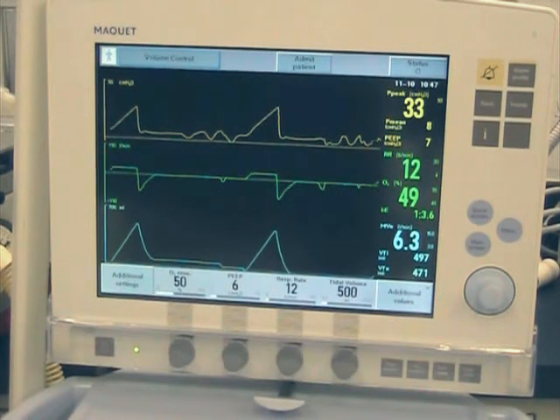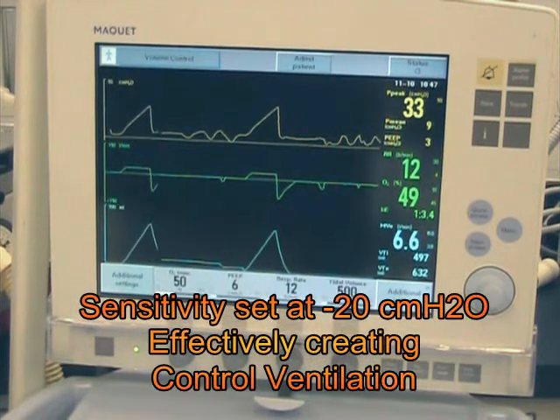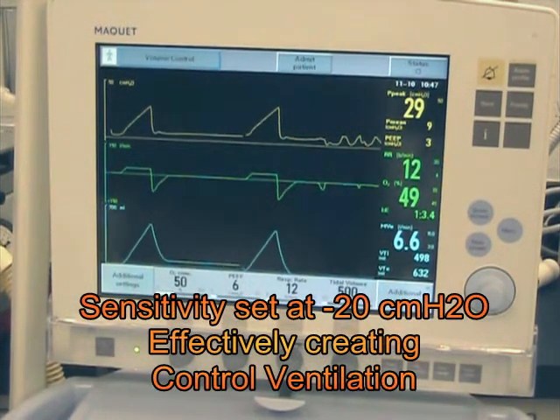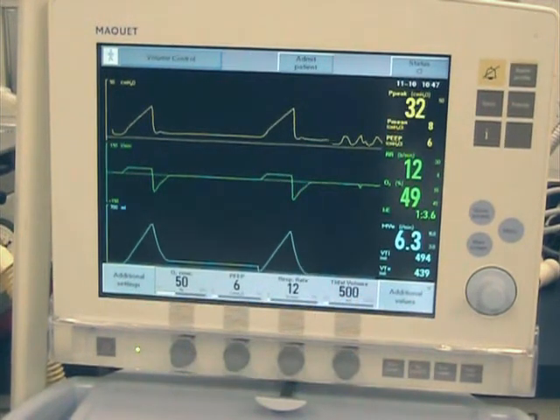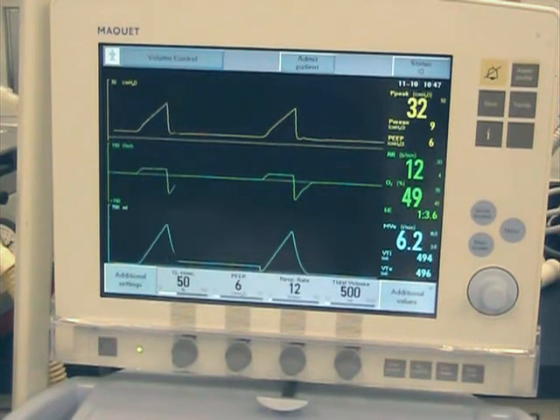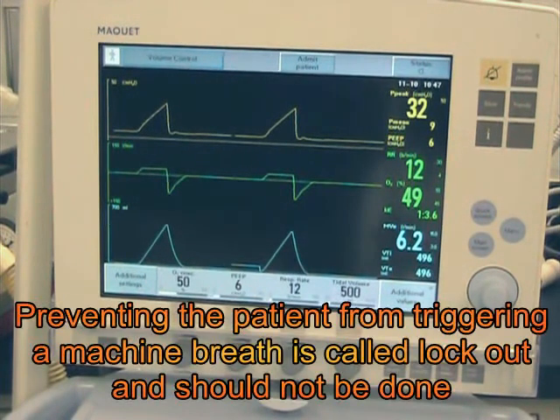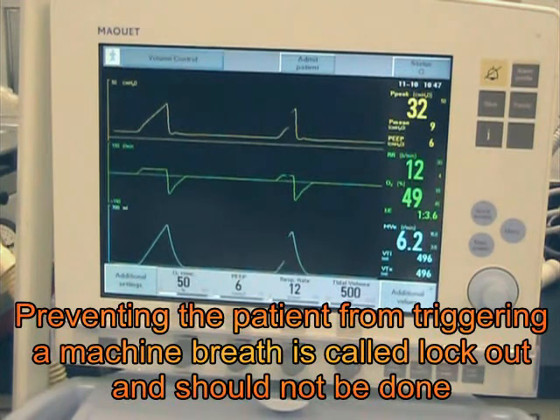This is because the ventilator is set at a negative 20, and the patient cannot generate a sufficient negative force to trigger a breath. If the patient did reach down to negative 20, then the ventilator would eventually trigger a breath for the patient.